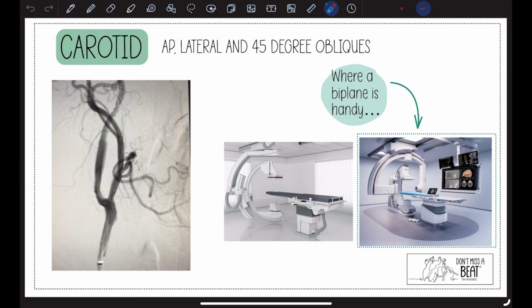And what that means is if you're taking your lateral shots, you have to rotate this all the way around to match this orientation, which can take some time. And you should have lead shields here, and you will kind of have to swing those out and adjust those after you roll this over. And please be mindful of the sterility of the cover that you have on the flat detector as well. But this is what we are going to look at.